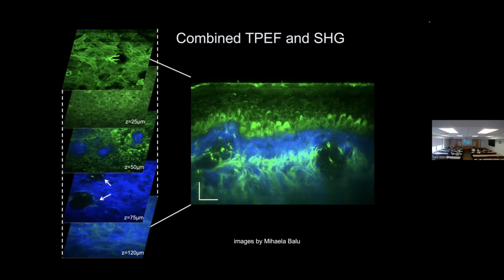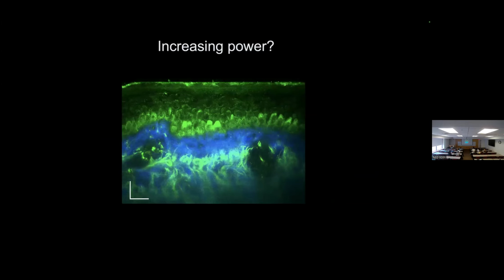Yeah, if you go to the first one. Okay. All right, so as beautiful as this picture is, I can tell you that the depth here from the top to the bottom is 120 microns or maybe 150 microns, which is enough to capture the transition from the epidermis to the dermis, okay? At least in this part of the forearm. But it's not generally true.